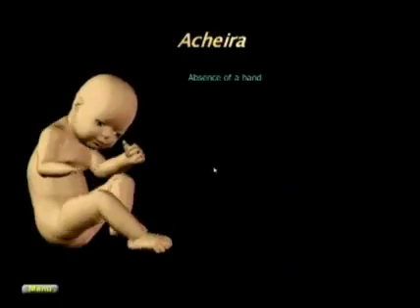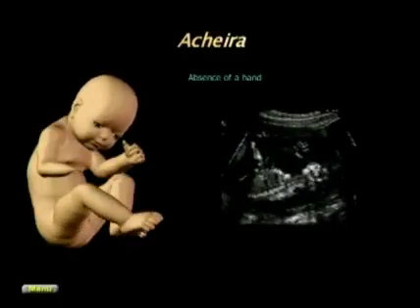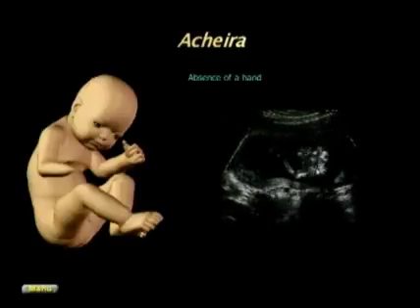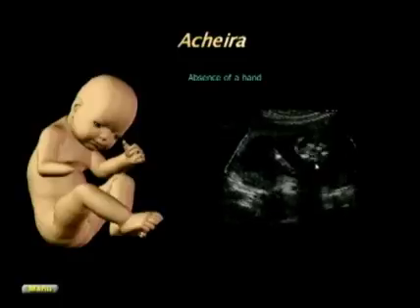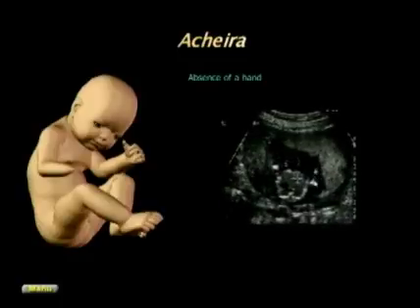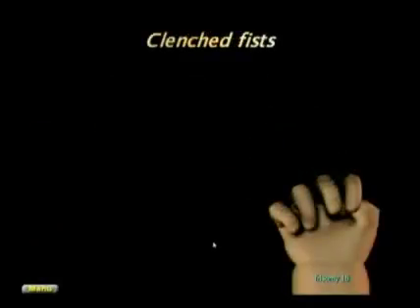Acheira is absence of a hand, and in this video clip you can see that the left hand was clearly identified during the exam, but as the sonographer looks into the heart and into the right arm, you see the right arm ends over here, and there's no hand at this arm.